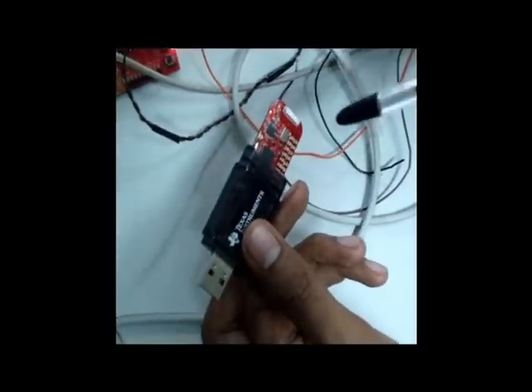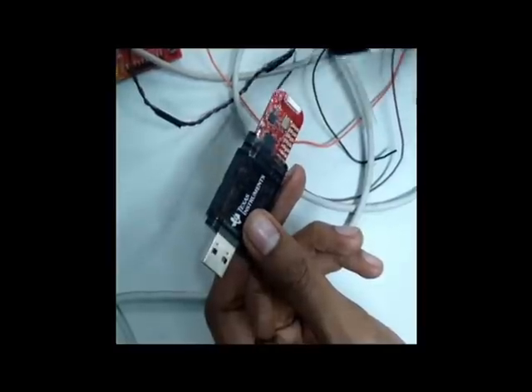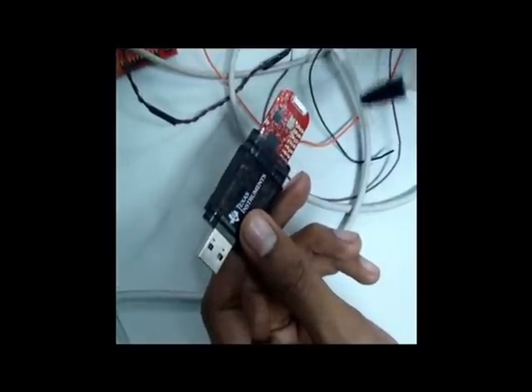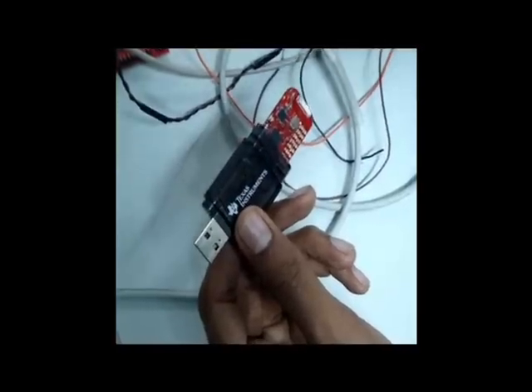Now coming to the receiver part, the receiver communicates with MATLAB serially at 9600 baud rate. It sends the sampled signals obtained to MATLAB, which uses a function to plot those signals and display the PPG waveform.